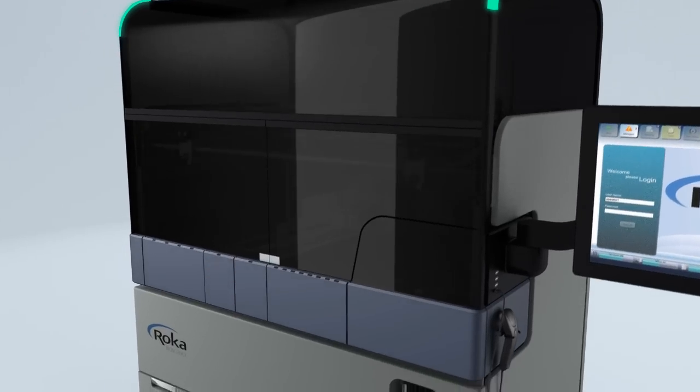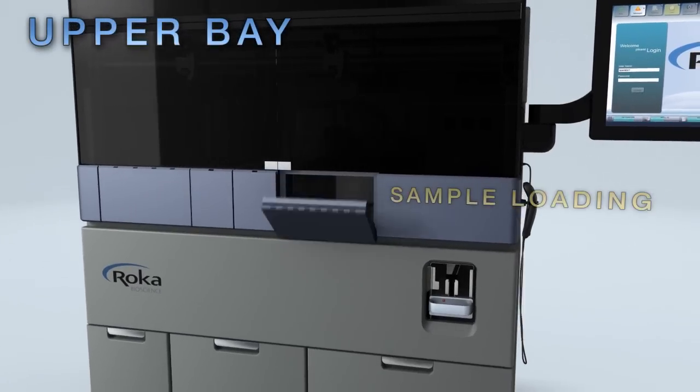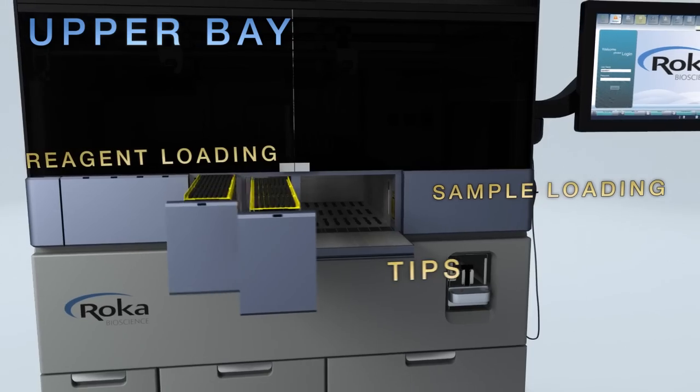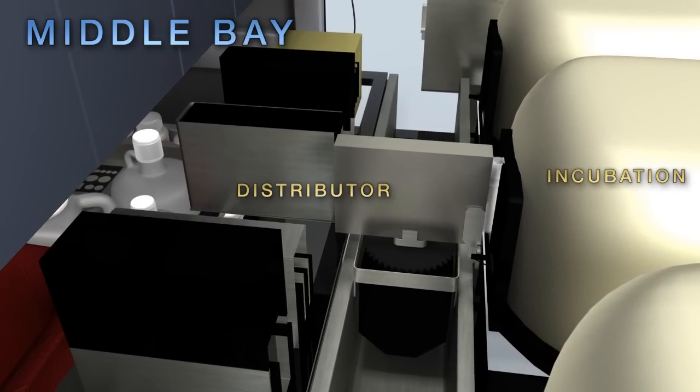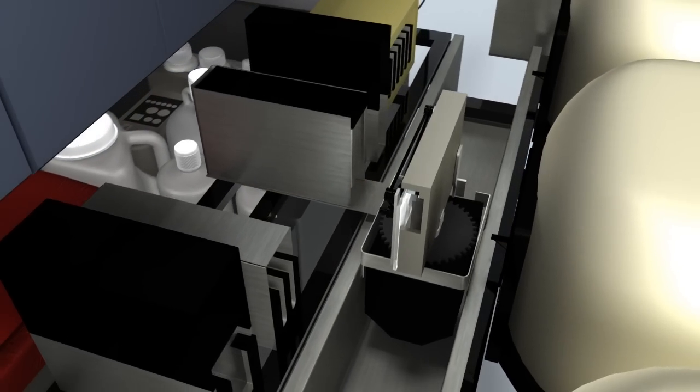The upper bay provides user-friendly access to load samples, tips, and reagents all required for testing. The mid-bay houses the internal mechanisms for sample purification, amplification, and detection all in a single reaction tube.